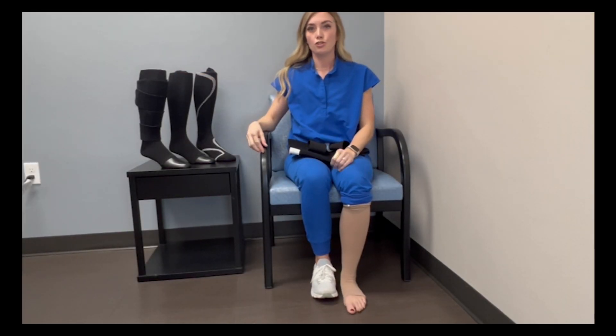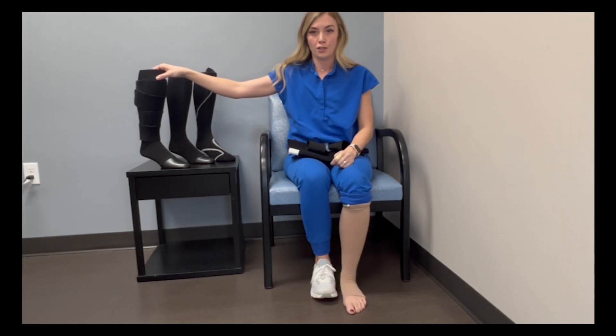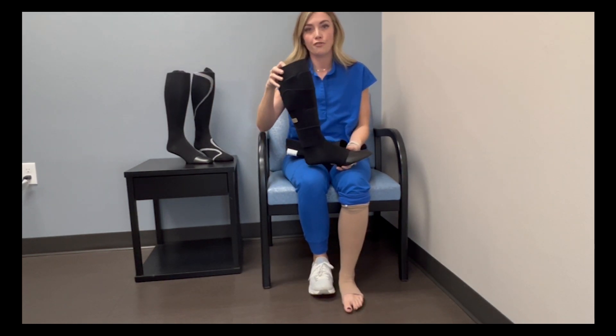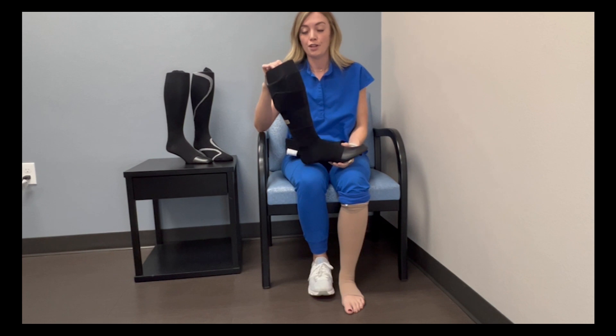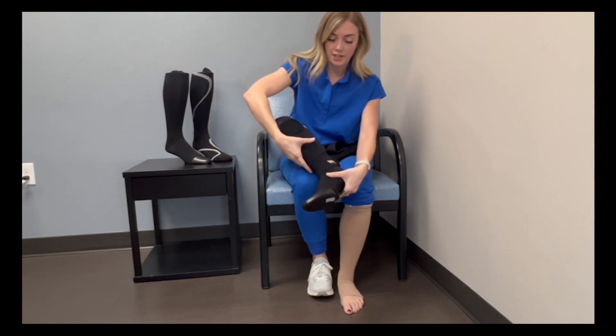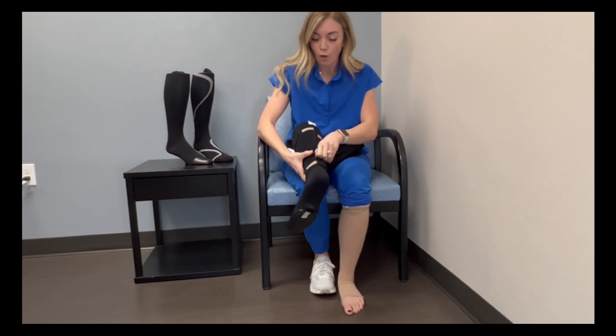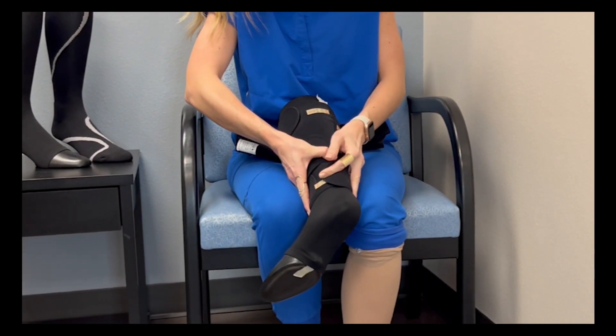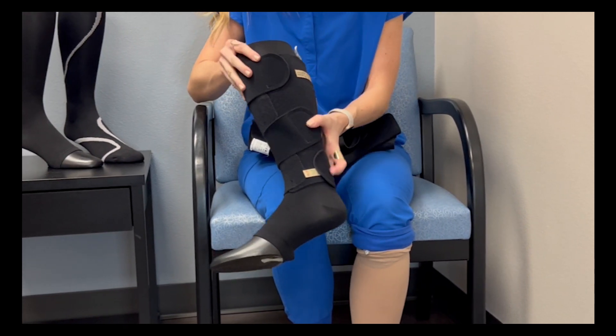The next thing I'm going to show you is an alternative option to compression socks — it is called Velcro compression. This is a great alternative for those who have a harder time putting on a compression sock at home. The nice thing about this is that you have these little tabs that you can pull the Velcro strap to the desired amount of compression that you would like.